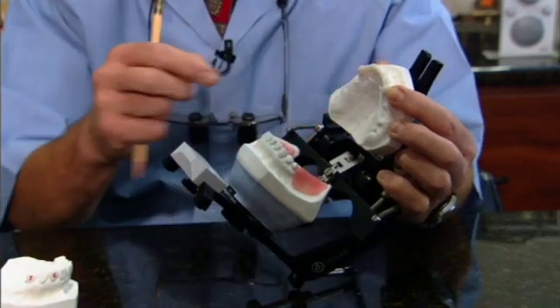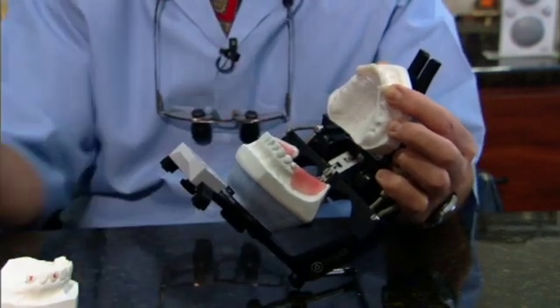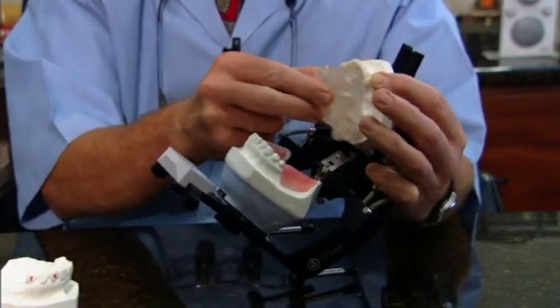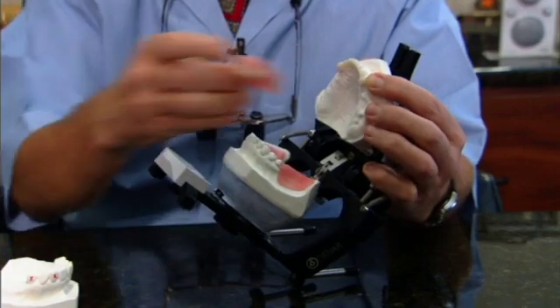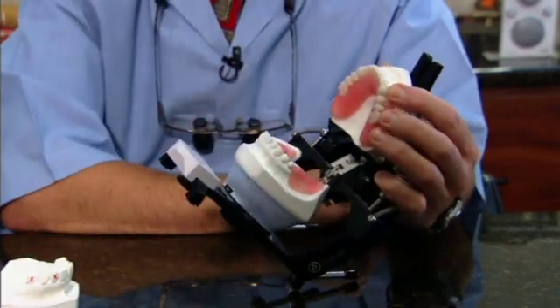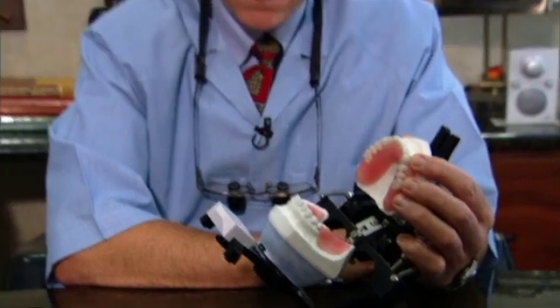No way you can do anything about it if you haven't set some denture teeth. And so by setting the denture teeth, determining where they've got to go, we have the ability to place our implants and know that when we get to the end of this project, we'll have plenty of room to work.